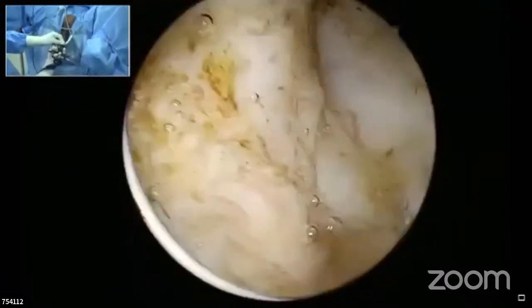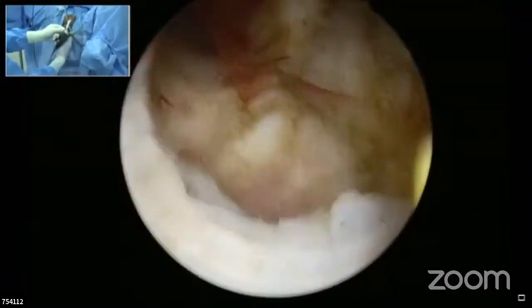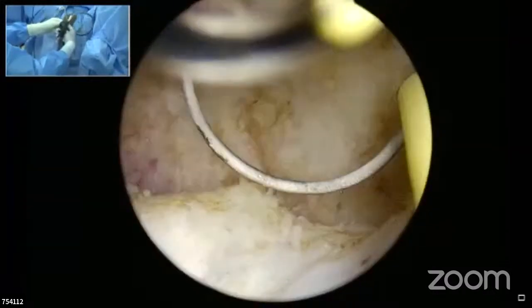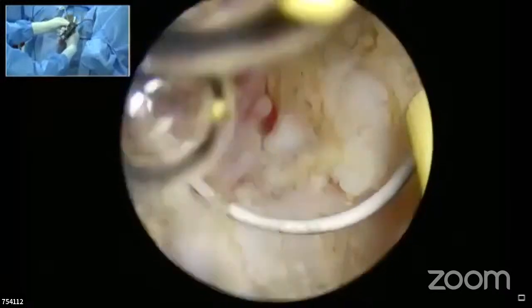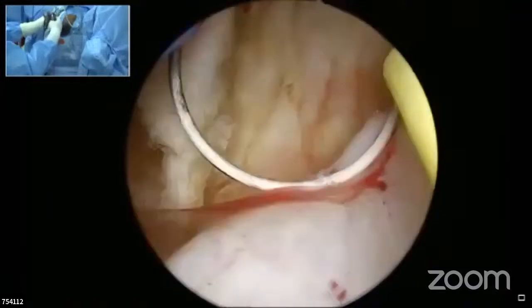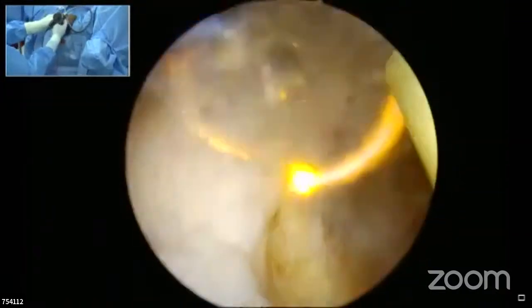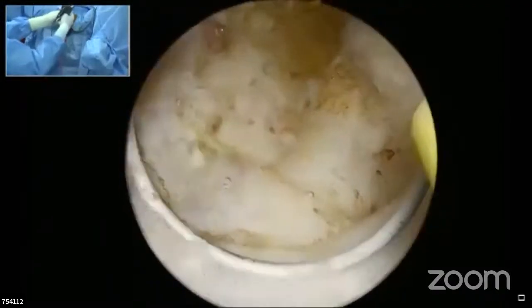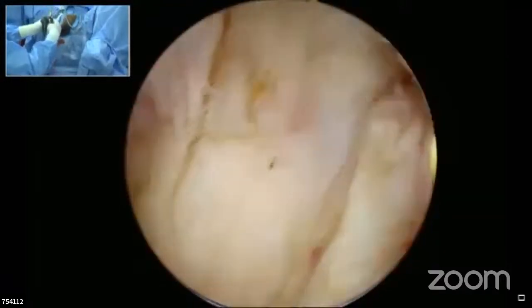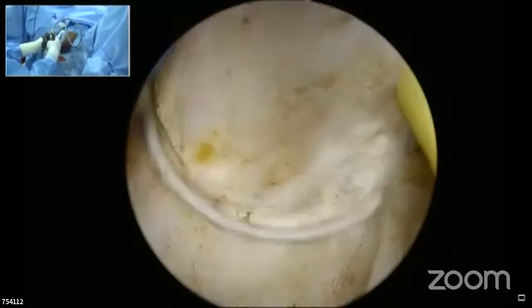There's another question: when you have capsular perforations happening, when do you decide to abandon and revisit later? At what stage? The reason for abandoning would be the stability of the patient's general condition. You can still continue with normal saline, where there is no infusion; the only thing is fluid overload that might happen. If you are not using glycine, you can monitor the hemodynamic parameters.